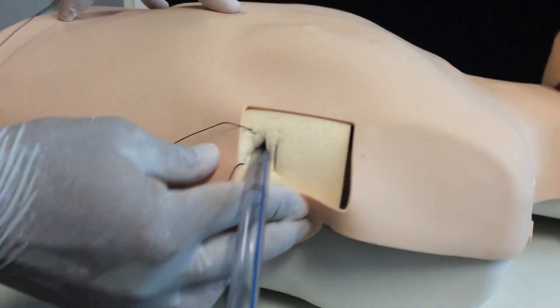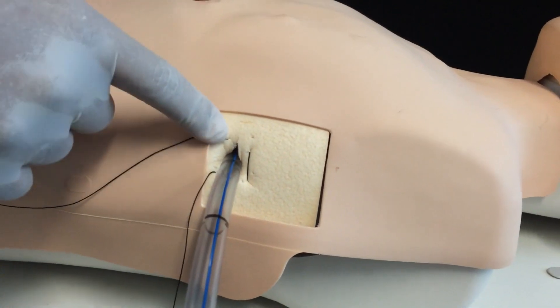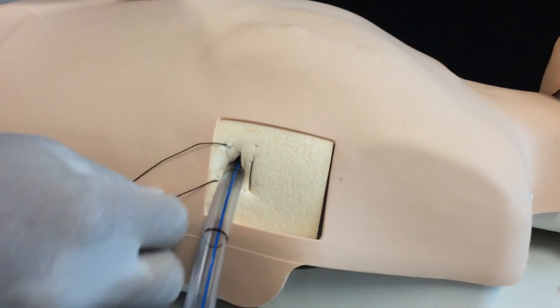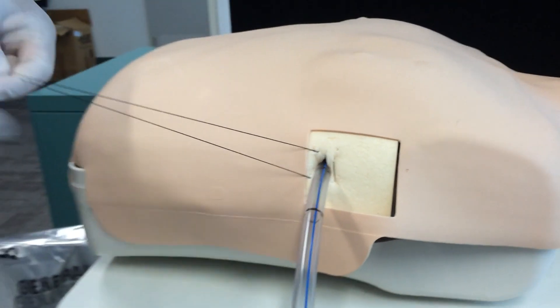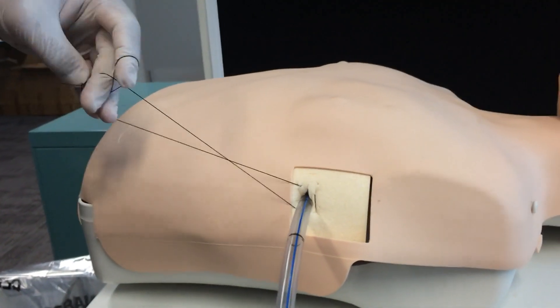So I put a horizontal mattress suture in and gone through over and around. And what you do is then you secure the knot in.